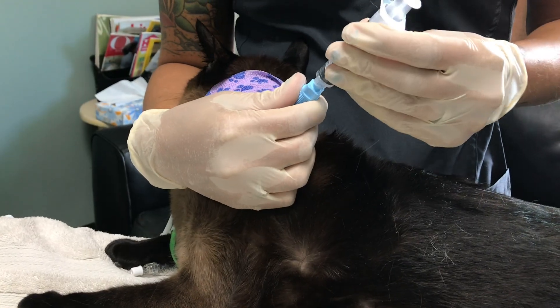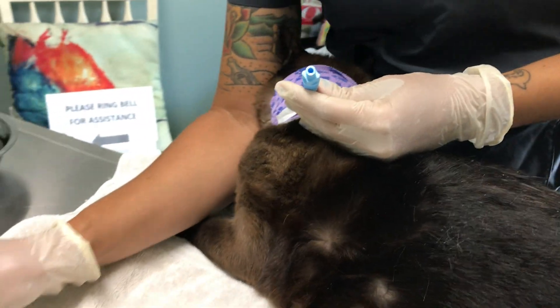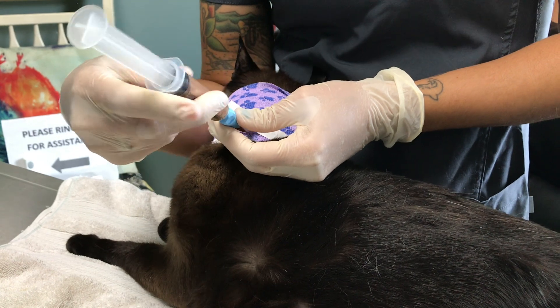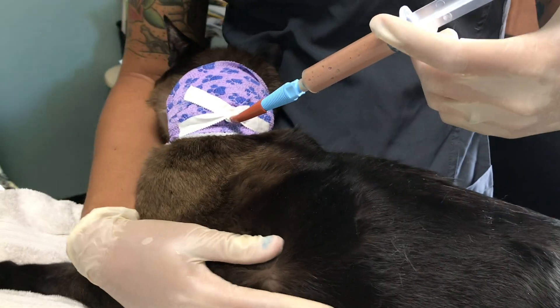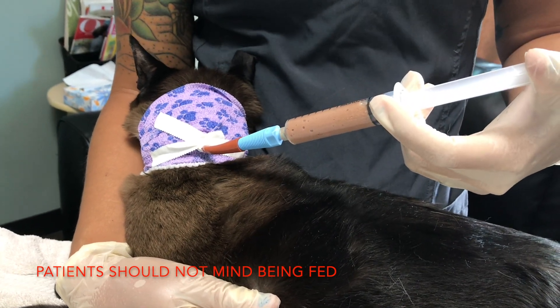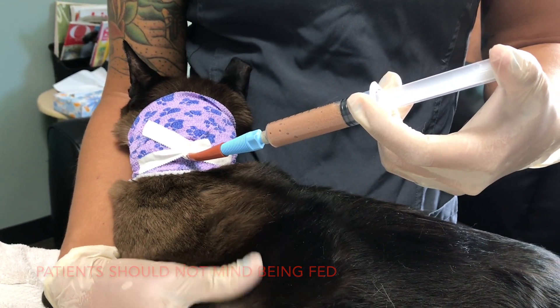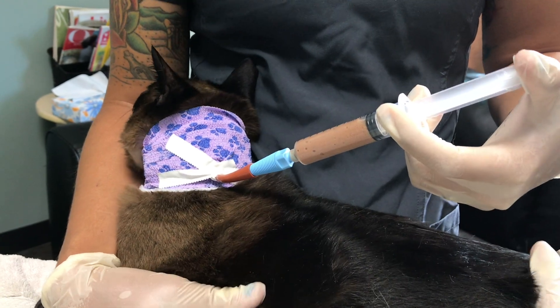I like to administer water first just to make sure that the tube is flowing and not clogged, and then after the water we can connect the food — our room temperature food — not too hot, not too cold, just so we don't make him nauseated. Then we're just going to administer nice and slow again, about five mils every one minute. At this time he's only going to get about 12 mils for this feeding.